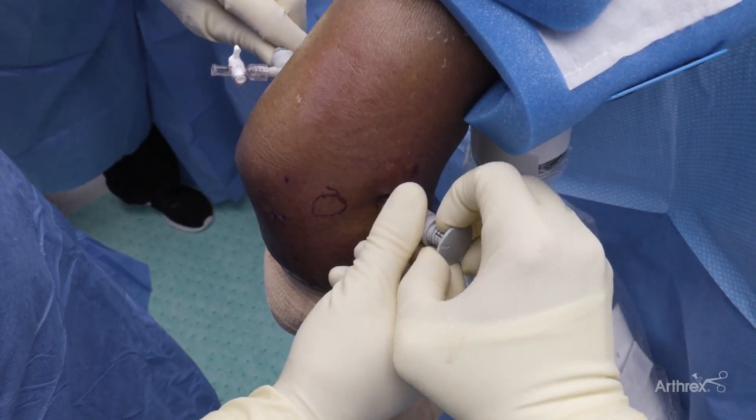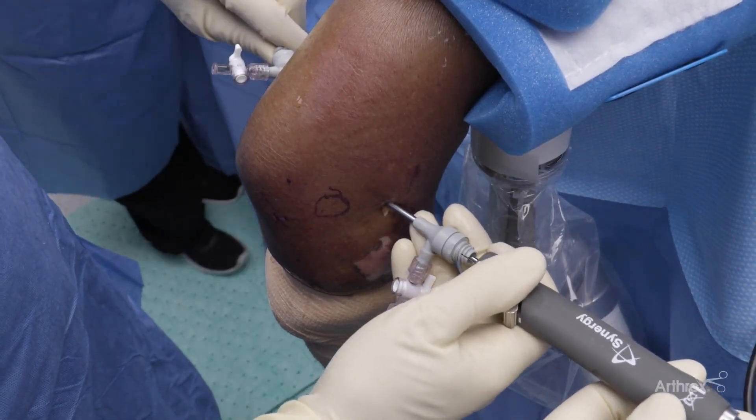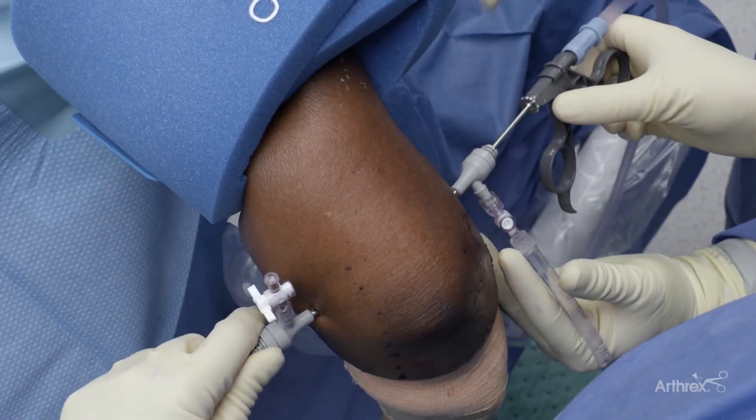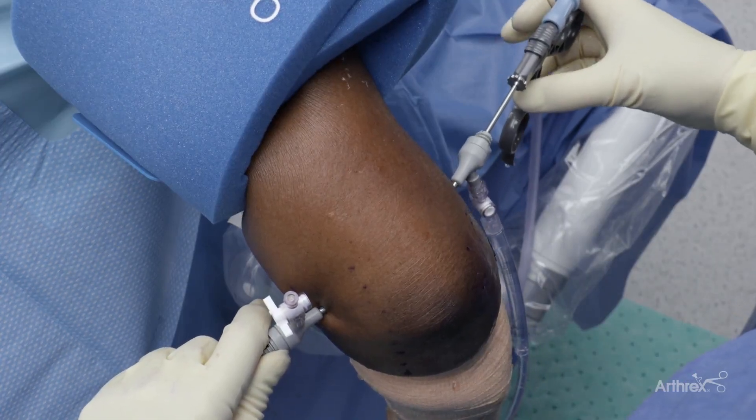Just below the synovium, there's the annular ligament coming around the base of the radial head. We have an excellent view of the radial head and capitellum, looking up at the entire capitellum. You can even back up the camera to see some of the coronoid. One of the niceties of this system is that we can shift our instruments right through this cannula. We're going to put our shaver in now. It's easily done because the fluid will stay with this cannula system. You can also add your suction punch for removing soft tissue, grasping loose bodies, and allowing you to do a variety of work from the anterior chamber.